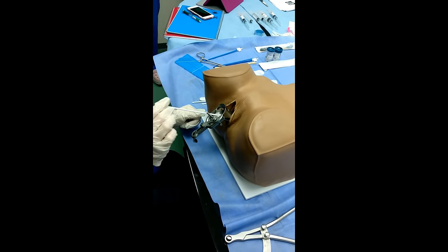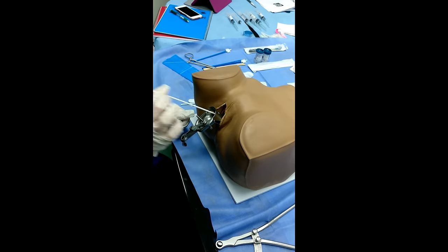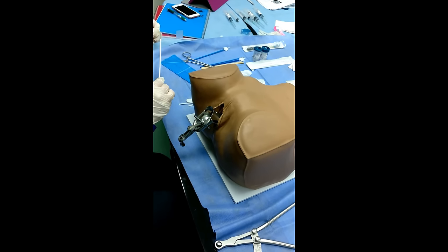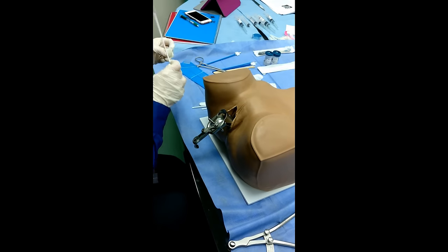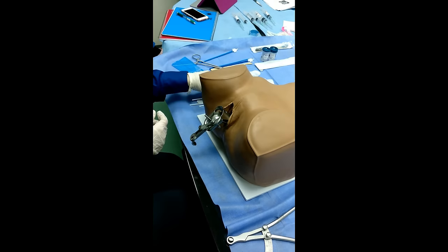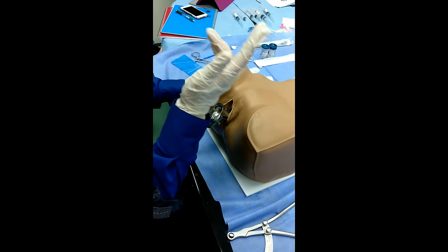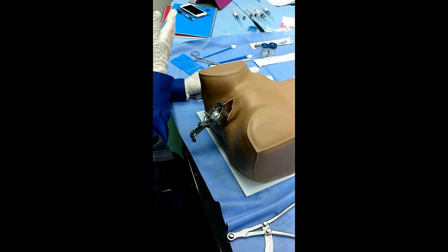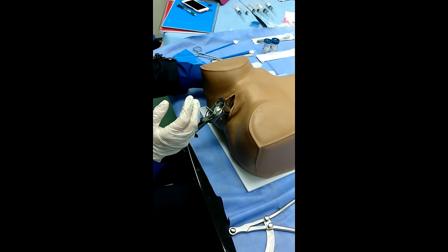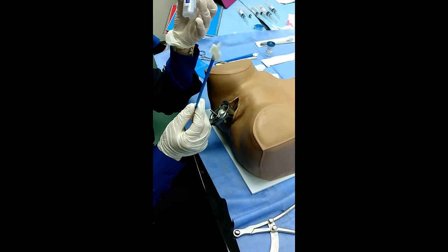Second is the brush. We introduce the brush into the cervical canal and by progressive movements we collect the endocervical cells, we apply them in a thin layer on the glass, we fix and we label. And we send to the laboratory with all the data of the patient, clinical diagnosis, material collected from the ecto or endocervix.